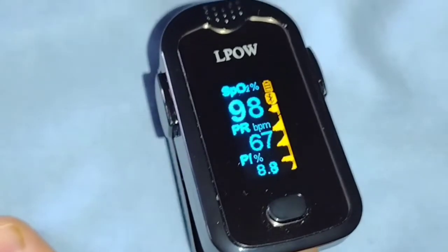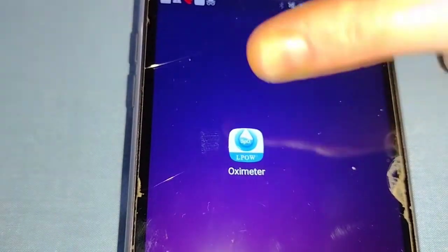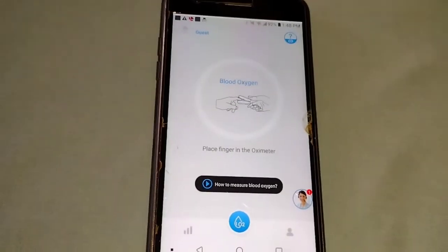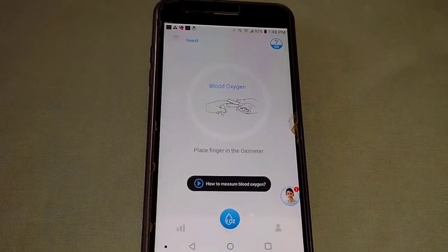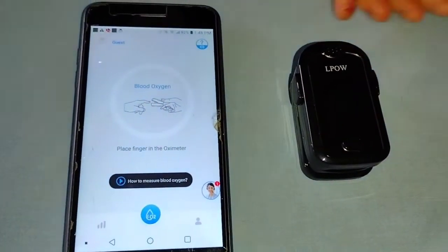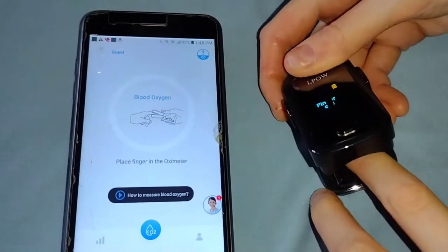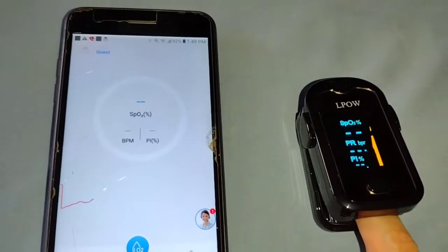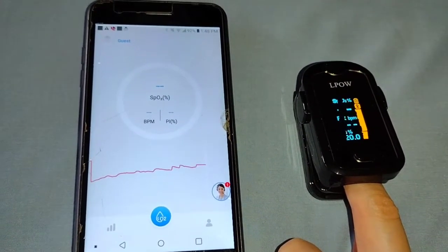The app that comes with the oximeter is available for both Android and iPhone. The instructions give details on how to download it, and once you download it and are ready to take measurements, you open the app, make sure you have Bluetooth on, turn on your oximeter, put your finger in, and in eight seconds you can see on your phone it's syncing up with the oximeter.